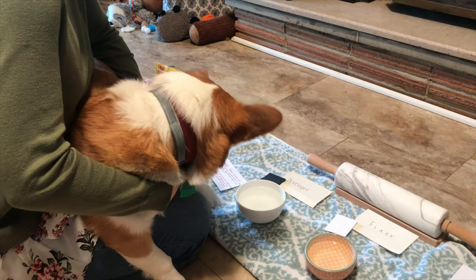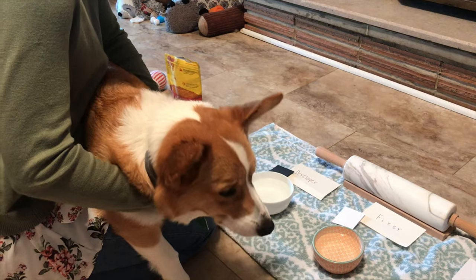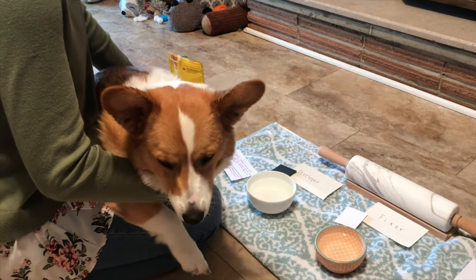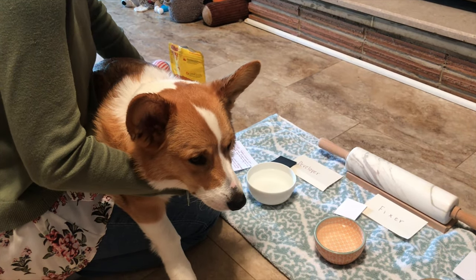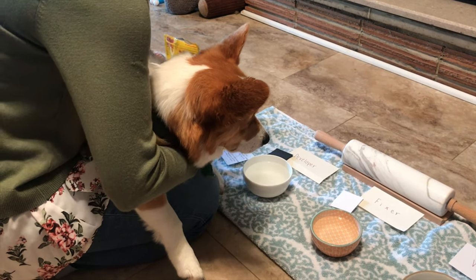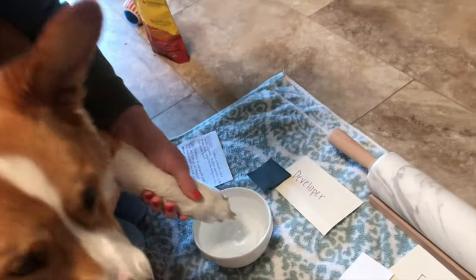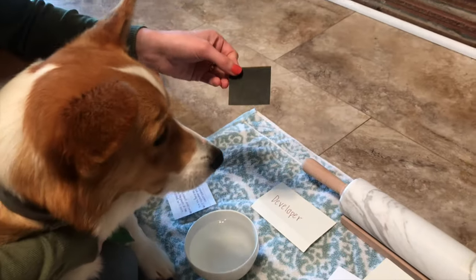The next step is the developer. The developer reduces the exposed silver halide crystals to black metallic silver. Basically, anywhere that the x-ray hit the film will turn black. So we're going to dip his paw into the developer, and that will turn the film black.